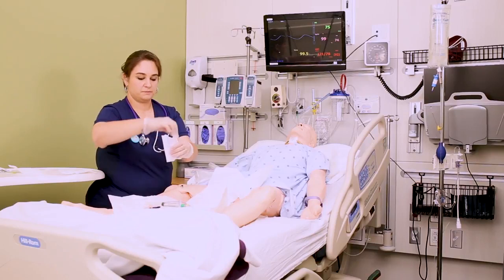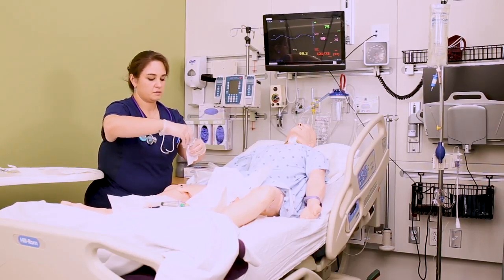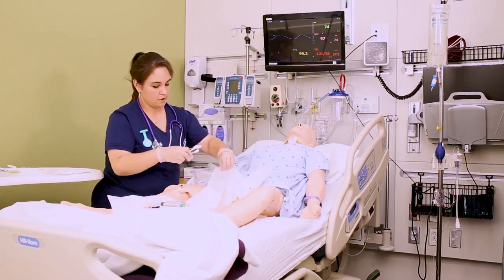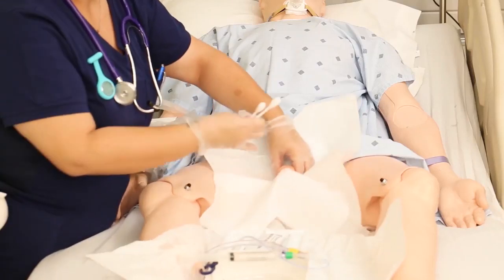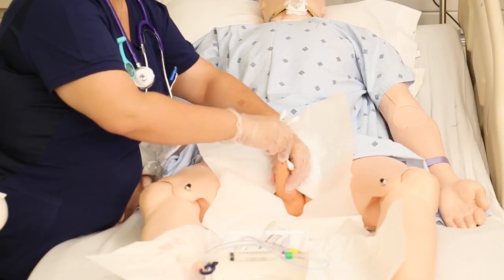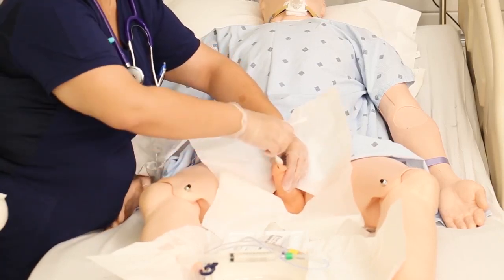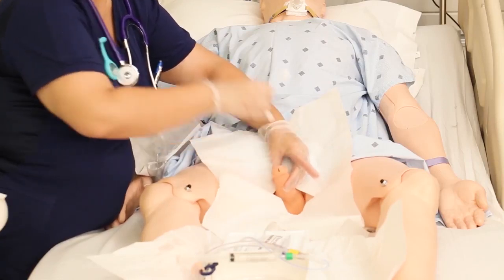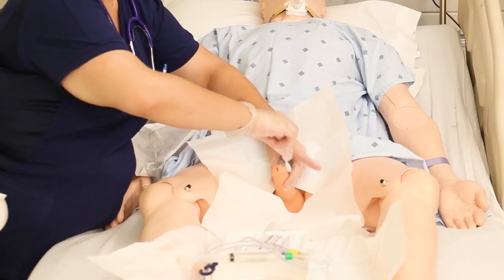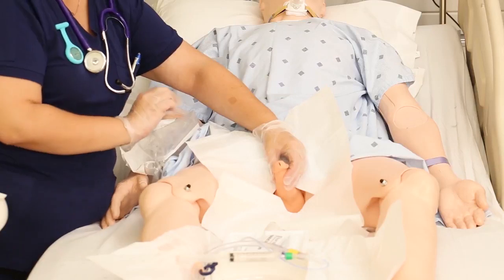Apply iodine to the cotton swabs or open your swabs package depending on what your kit has. To clean for a male, use your swabs or cotton balls starting at the meatus and work your way around. Always warn the patient that they'll feel you touching them and feel a cold cleaning scrub, then work your way around and down the shaft.